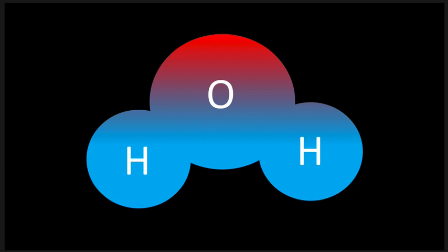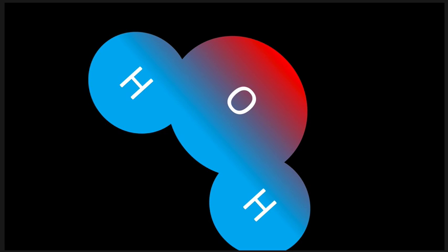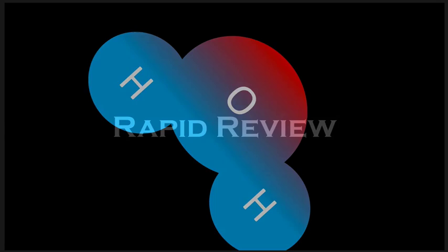It's highly susceptible to that. So it spins very fast. And remember, because of that, and I'm going to make this matter later, this spinning is the reason that it's not good at transferring its energy, and therefore it has a long T1 time, and therefore it's darker on T1.